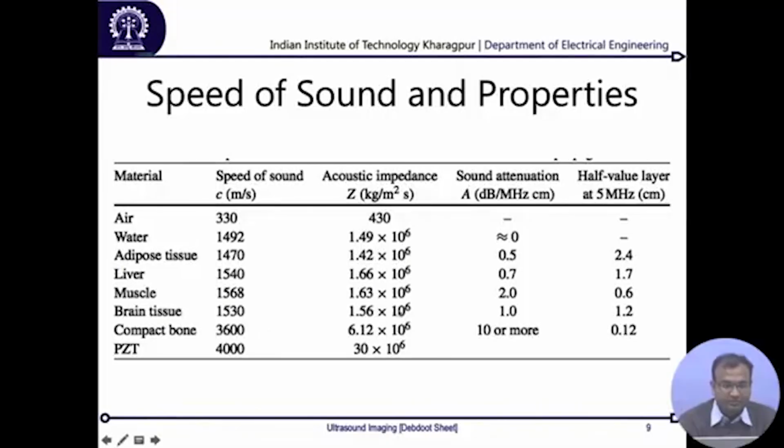Okay. So from there, analogous to the refractive index which we have for light, we also have an acoustic index and an acoustic impedance for different materials as well, and this is a list of the different acoustic impedances. And if you look carefully over here, the acoustic impedance of air is much lower than all of them, which have acoustic impedance in the order of 10 power 6, and that is the reason why if you speak in air, multiple people can hear over longer distances, whereas over here, since the acoustic impedance is much higher, it will die much faster.